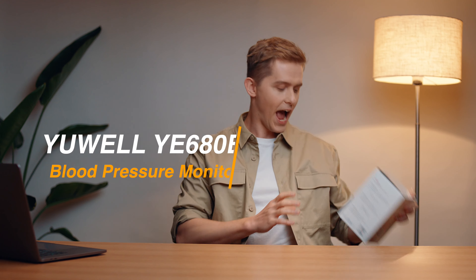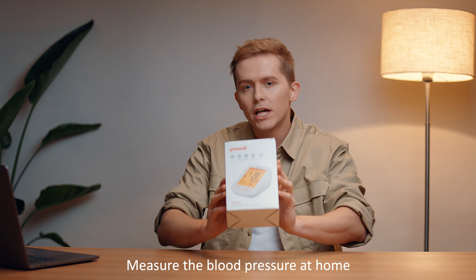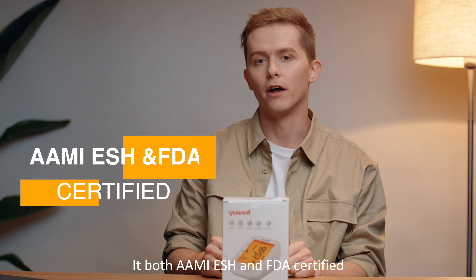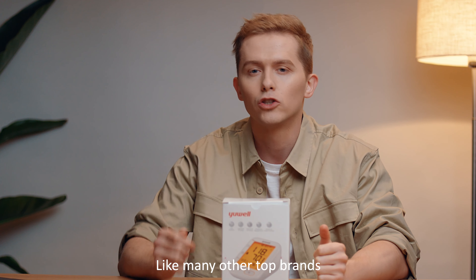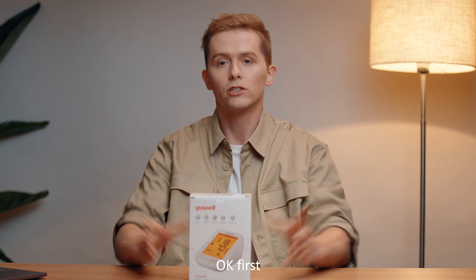Hi everyone, let's take a look at Uwell's electronic blood pressure monitor, perfect for those who wish to accurately measure their blood pressure at home. It's both AAMI, ESH, and FDA certified, and is high quality and easy to use, like many other top brands, but with this you also get a super affordable price point.